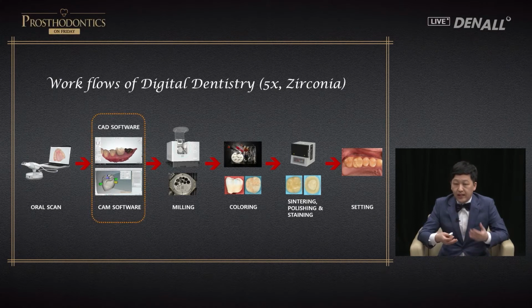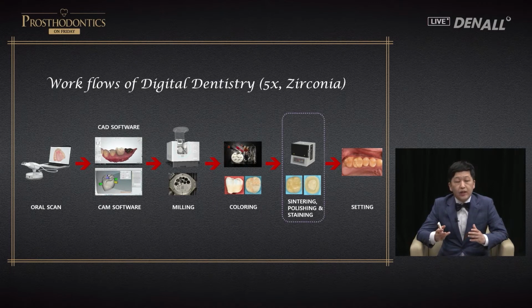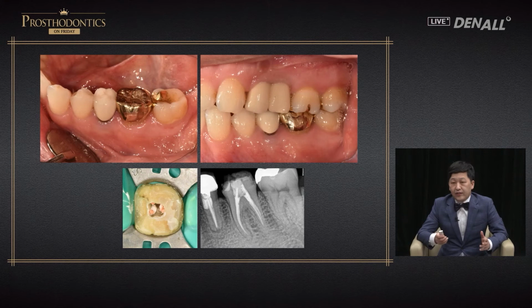Oral scan is done. CAD/CAM software is used for design. Milling is done. Before firing, coloring is done to give color. And then polishing or staining is done to add even more color. It is afterwards set like this. Let me show you a recent case.